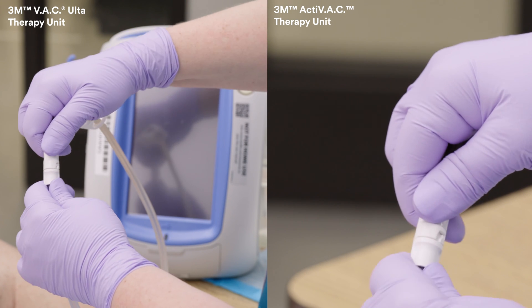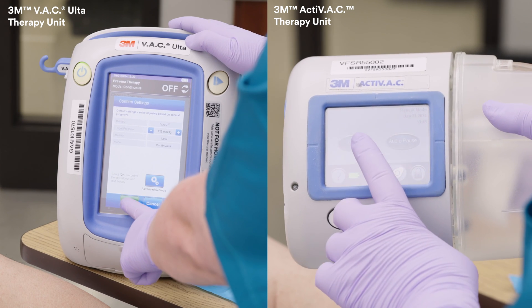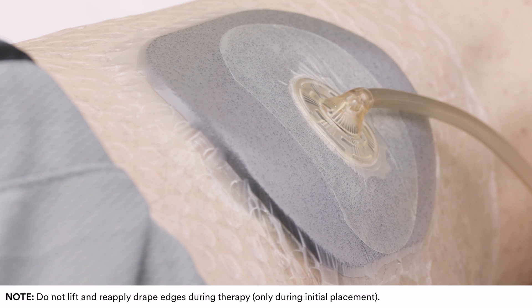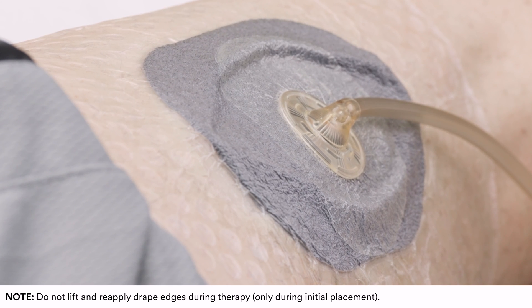Attach the tubing to the appropriate 3M VAC therapy unit and start therapy. The therapy unit should indicate a good seal. Once therapy is activated, the dressing will conform to the wound and deliver an effective seal.